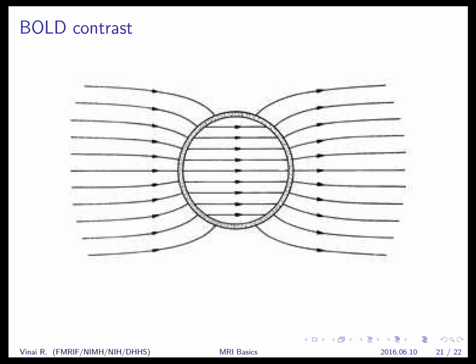So this is why you have a particular sequence for your structural scans. Those, we make T1 sensitive. For our functional scans, we take measures to make them T2 star sensitive. So this is why I was saying it's so cool that the pulses themselves from sequence to sequence are different, but they're not so different. But the big difference between the different sequences is the timing of the different pulses.